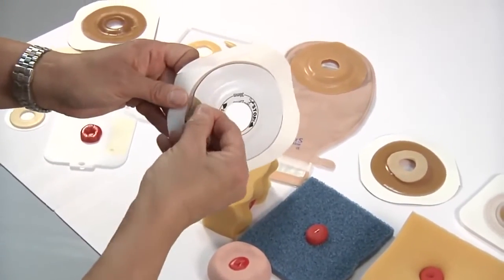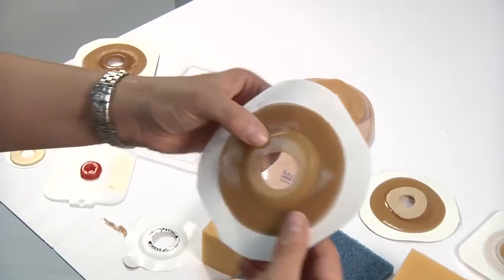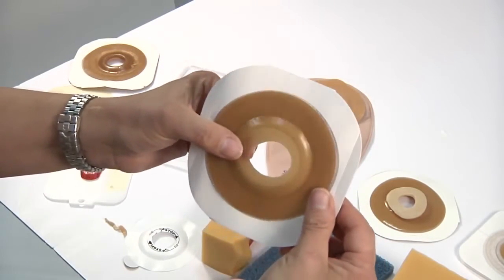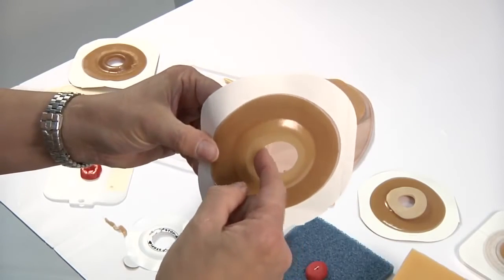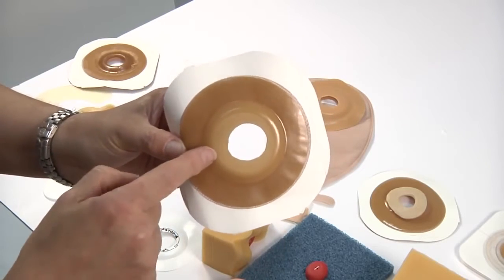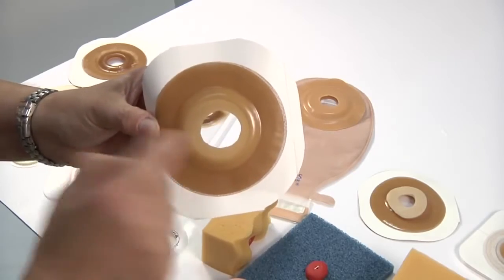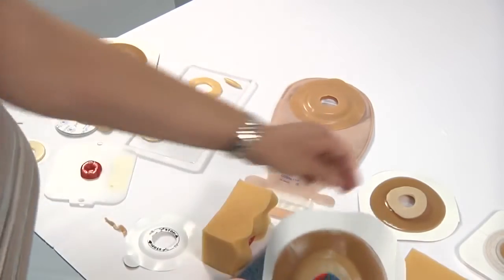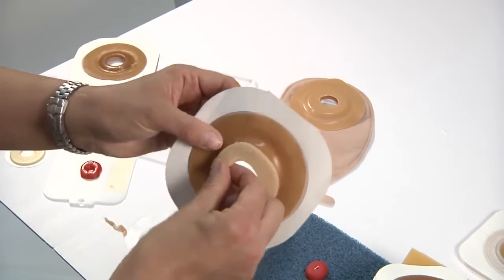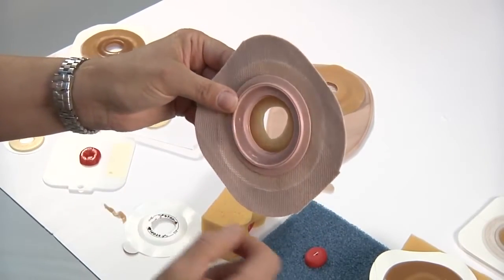And what you would need to take note of, and we'll see if we can actually demonstrate what the difference is here, is that, again, this is somewhat like the soft convexity in that you can see that there's absolutely no rigidity here. You can actually move it back and forth. So your point of tension, where it's going to provide support, is way out at the periphery here. And if you're expecting it to provide tension right at the inner part here, it's not going to be able to do that. As opposed to this one, I can't get the barrier off on that one, but the tension is actually right where the opening is, on this particular one.